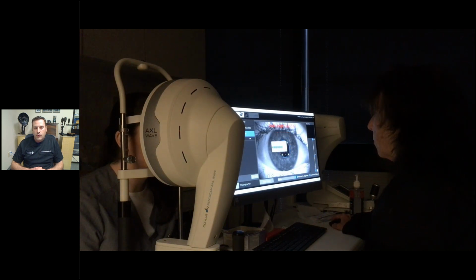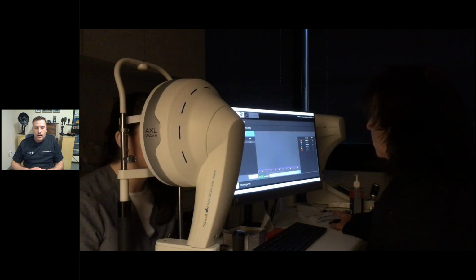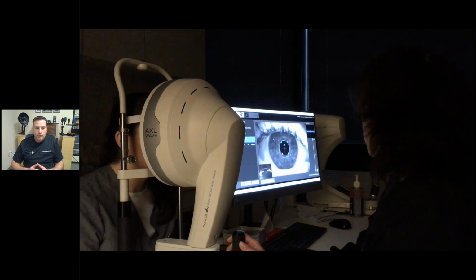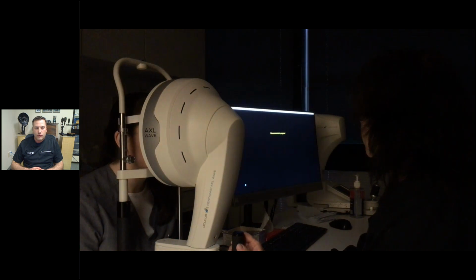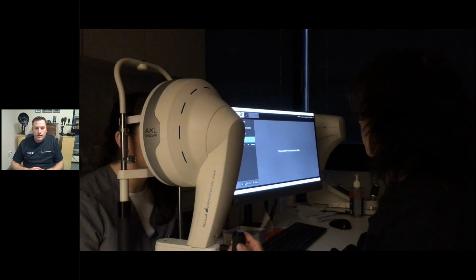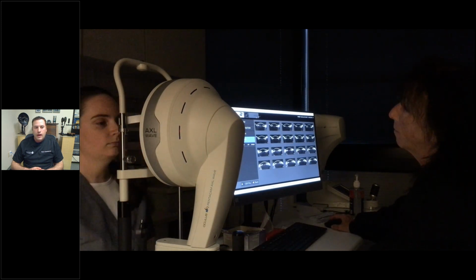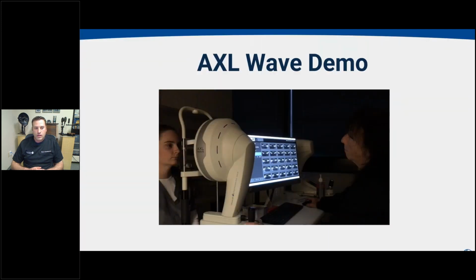And then we move on to the portion of the Pentacam which most people are the most familiar with, which is the tomography measurements. And this is the portion where all the Pentacams sort of work in a similar fashion. When you line it up with the vertex, it will automatically capture the Scheimpflug images in a rotating camera, and then you have all of what you need for one eye.